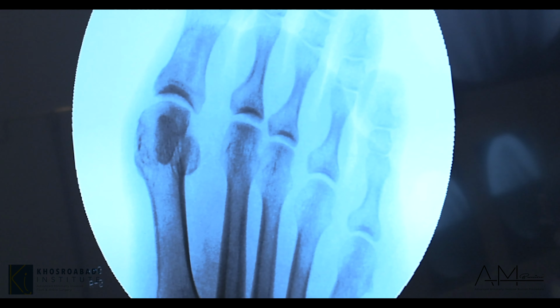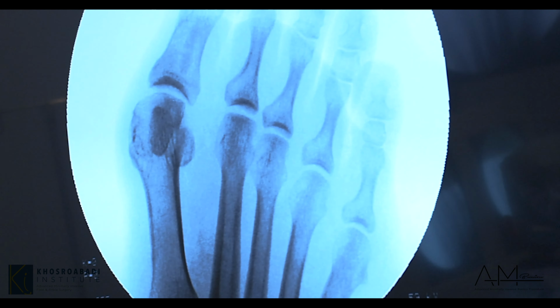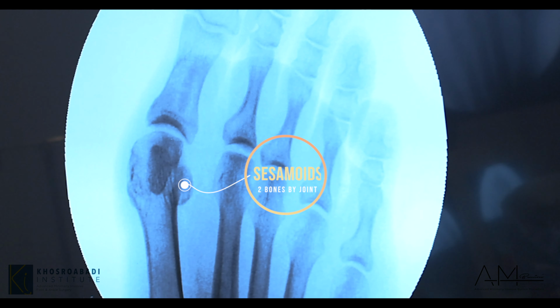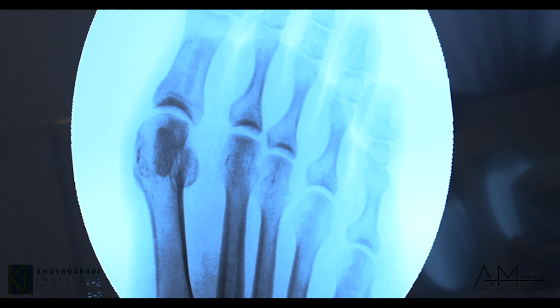On the x-rays, as you guys can see, the joint is jackknifed. We're going to make a bone cut right below the sesamoids, or where those two little balls are, and then make a cut and push it in and then straighten out the toes.